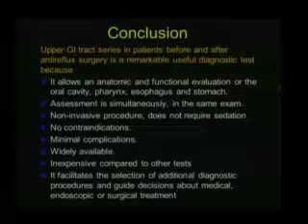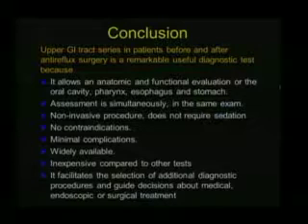It's non-invasive, does not require sedation. There are usually no contraindications, okay? If you suspect that there is a leakage, you just change the contrast for iodinated or water-soluble contrast. Minimal complications, widely available. Not always there is a radiologist to perform this exam, but the equipment is widely available. It's inexpensive, okay? And it facilitates the selection of additional diagnostic procedures.